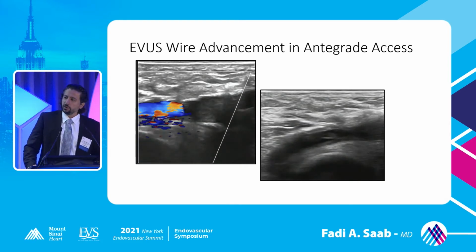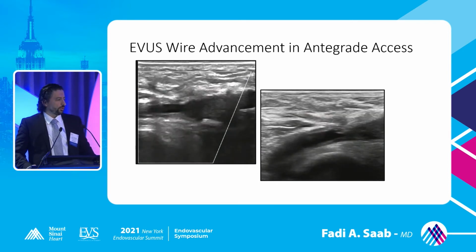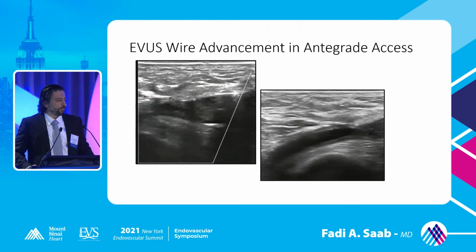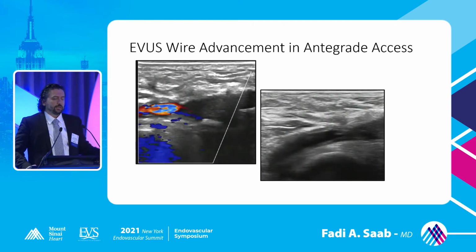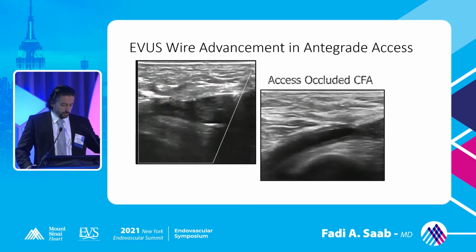It's a hypoechogenic space. This is not acute. This has been going on for a while. So I can puncture the occluded vessel into the patent segment of the common femoral artery and take a high complexity case to a much easier, a much more comfortable case.